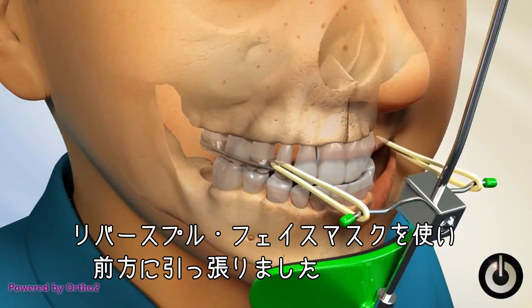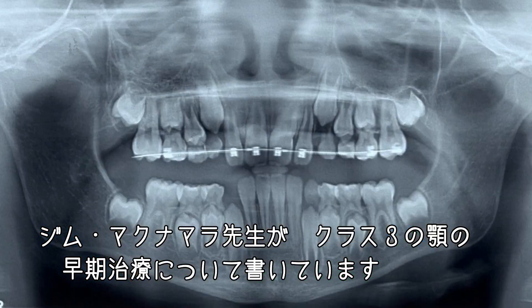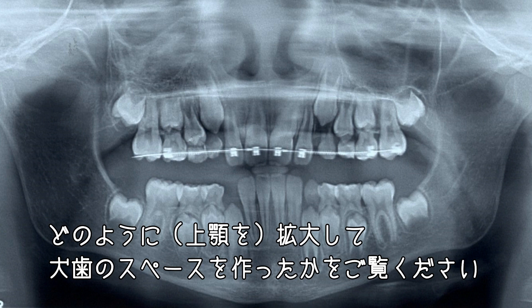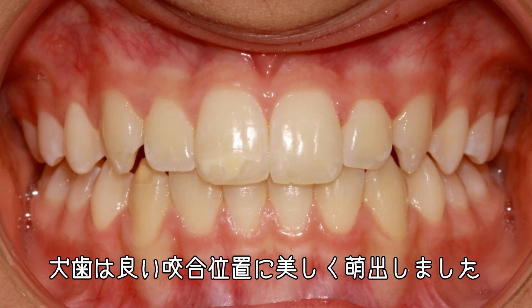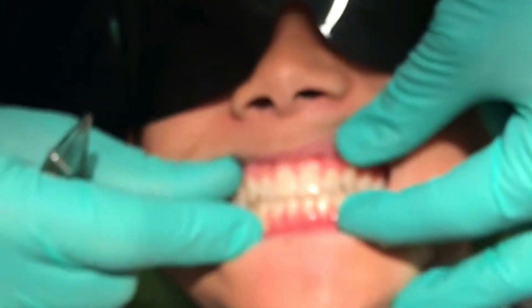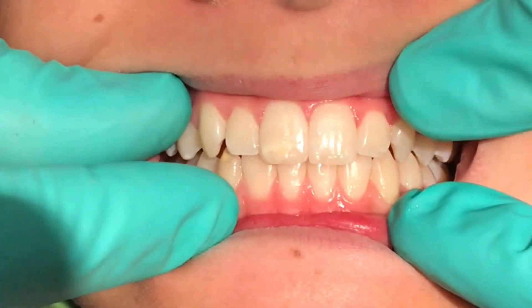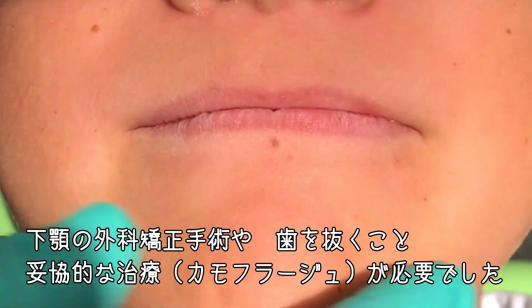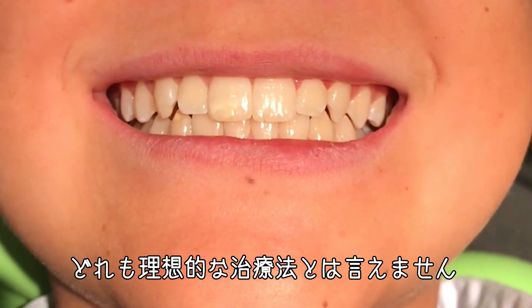This is very much what Jim McNamara has written about in early correction of class three jaws. By widening, we made room for the canine, and the canines have erupted really nicely into a good bite. Had we not achieved a positive overbite and overjet at an early age, the fate may have been orthognathic surgery on the lower jaw, extraction of teeth and dental camouflage — none of those are the ideal treatment.